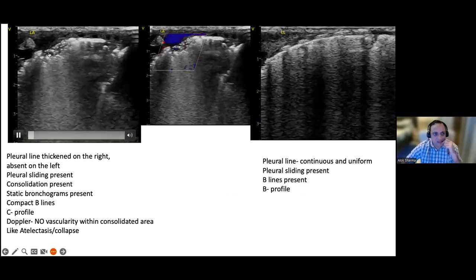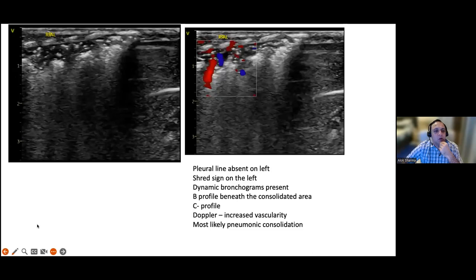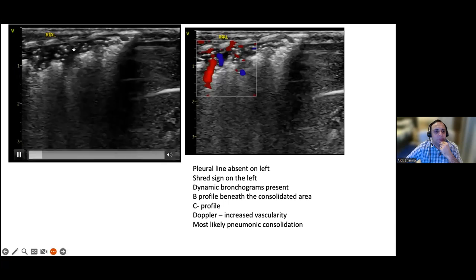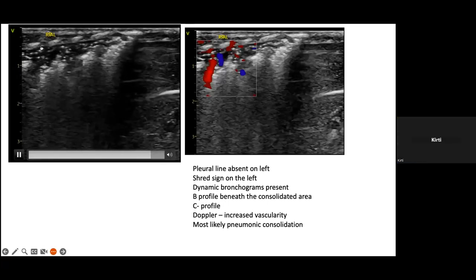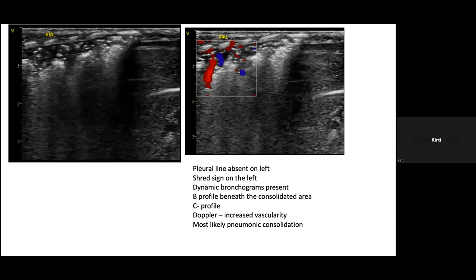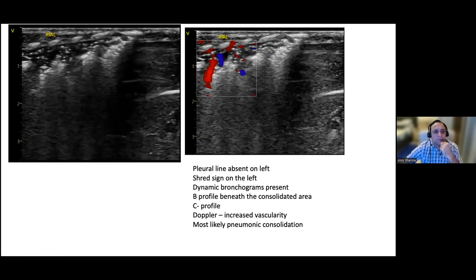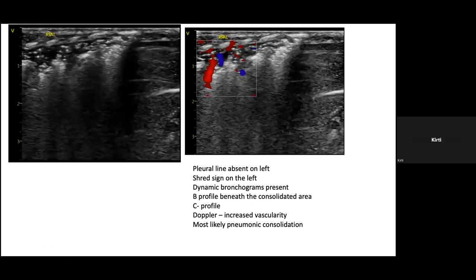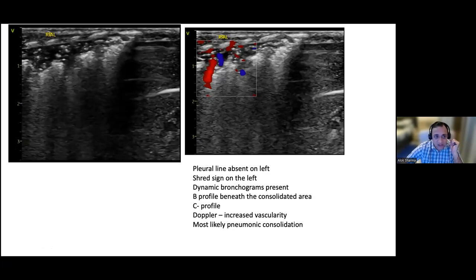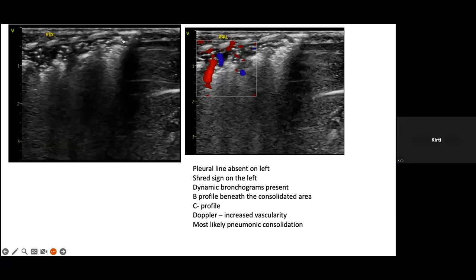Can I just go back to your previous slide? So when you look at the top of the slide, just go to RPAL. Yeah. So that thin margin that you see there is parietal pleura. Okay. Yeah. And basically what's happened is the visceral pleura is completely destroyed because you have consolidation. Now, if you have intact pleura, that means there's aeration there. Now, if you have aeration there, that's the giveaway, you have dynamic air bronchograms. So that's a point that goes against complete atelectasis.